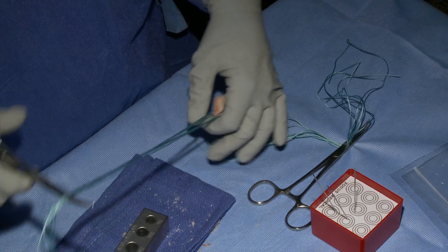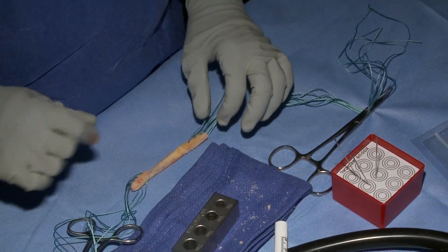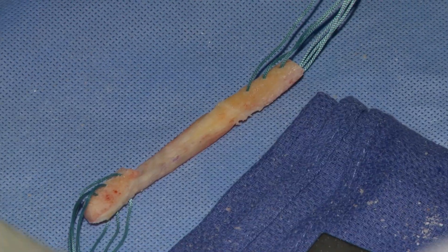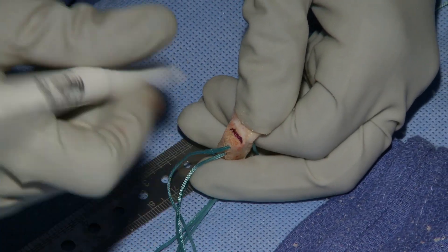It's really important to take off only a tiny bit of bone and tendon at a time so that you don't make it too skinny. You do not want any loose space because it won't allow for adequate fixation in the femur.